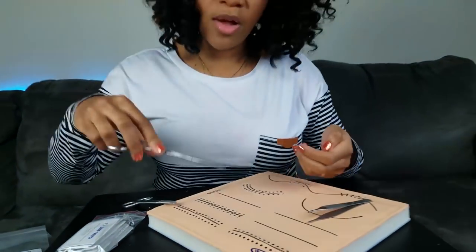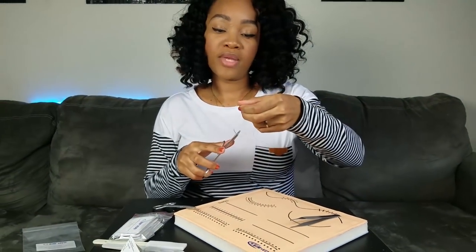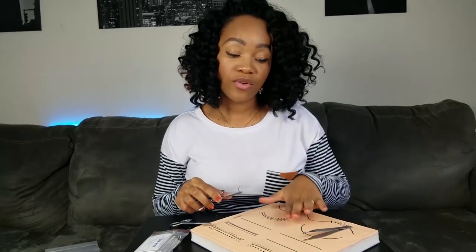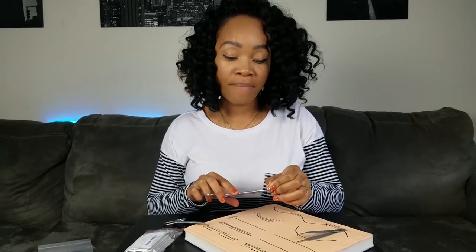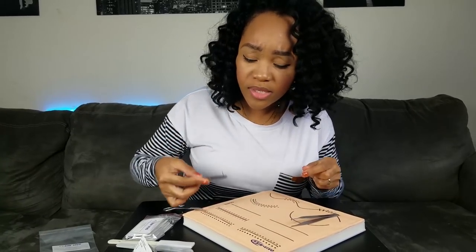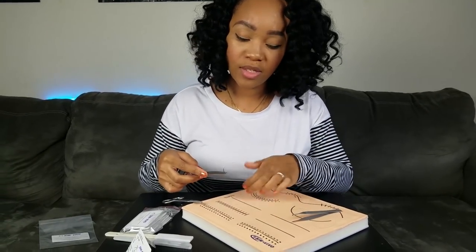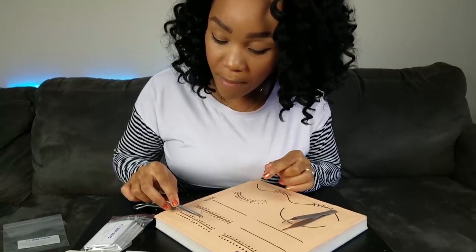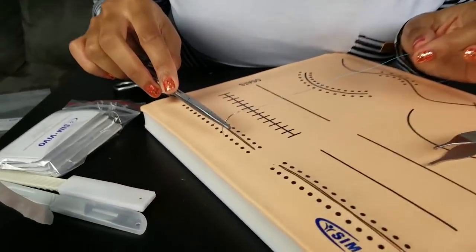So when you do it in the middle, you then have to stitch it halfway through. And you guys, I really like this trainer. First off, the trainer that I'm using in school, it's really like gelatinous and oily, and so it makes it a little bit difficult for us to actually do the stitches. But it's really good to learn because, you know, your skin is gonna have a little bit of give, obviously, with it, but sometimes it makes it a little bit hard.